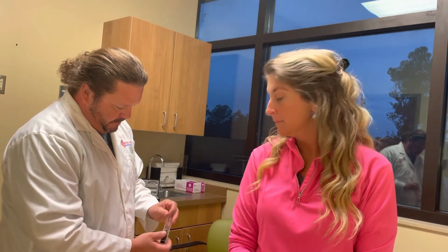Let's go ahead and take a look inside your ear real quick. I'll switch out the head here. And we're going to put a fresh speculum cover on this otoscope.